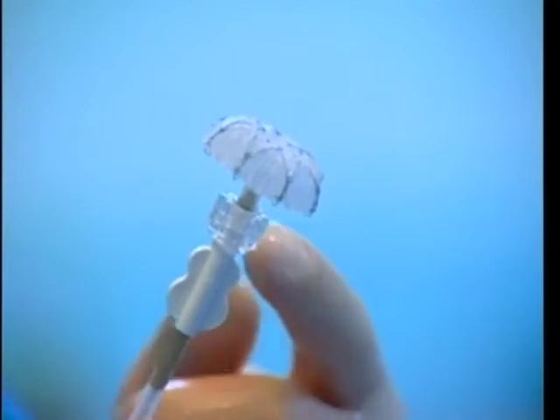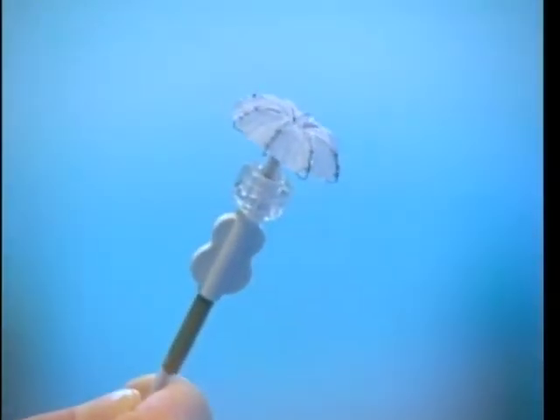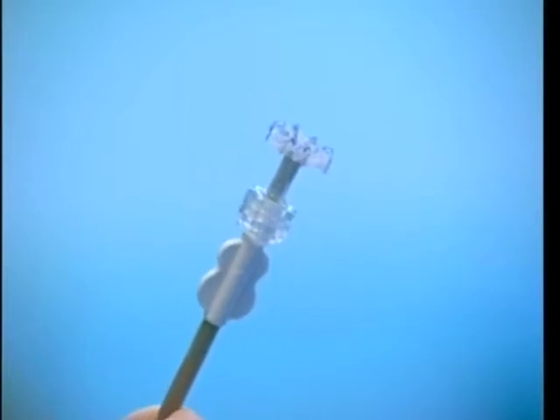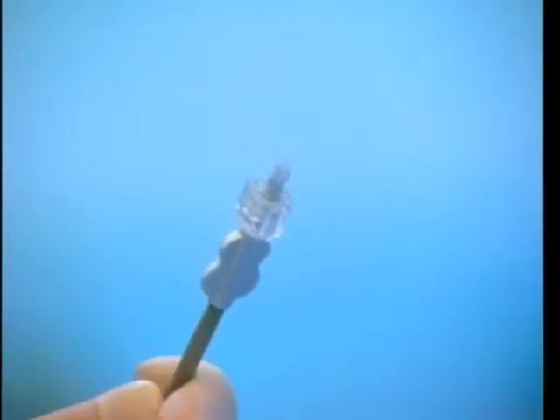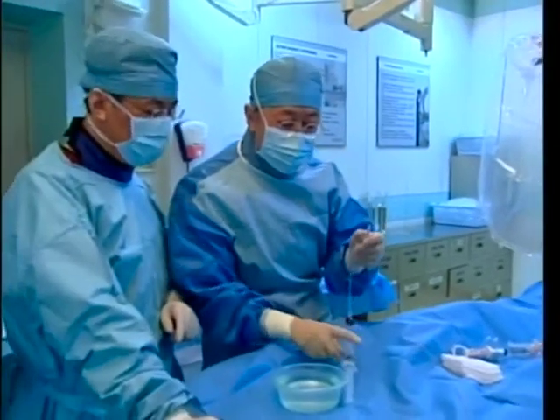The big hooks are bended, so this is automatic. You can again see the big hooks at the far distal, and this is bended. And as Dr. Park will show during the deployment, it's important not to open the umbrella deep inside of the appendage, in order to avoid these big hooks getting into the wall.